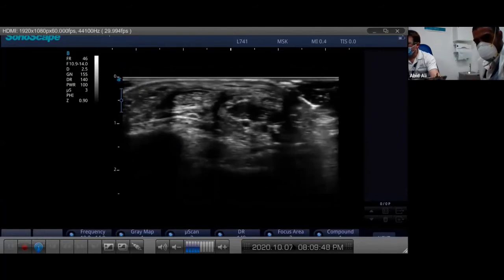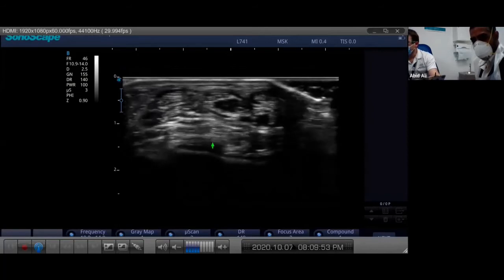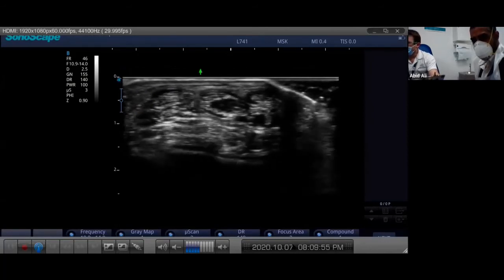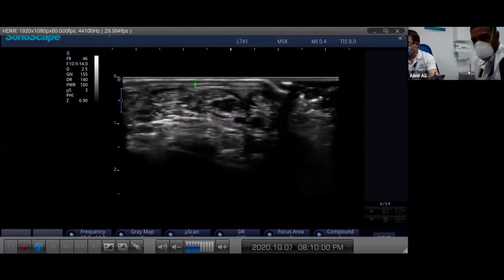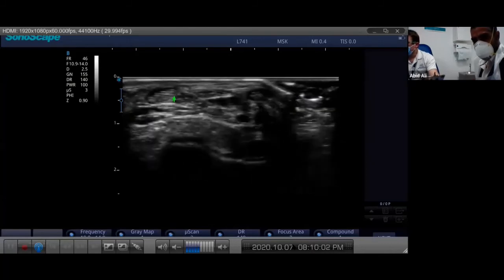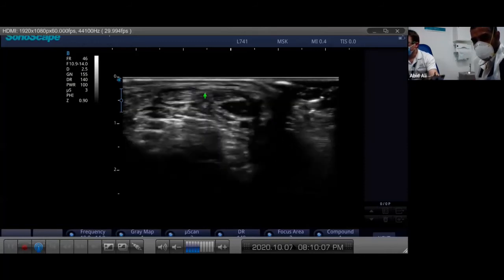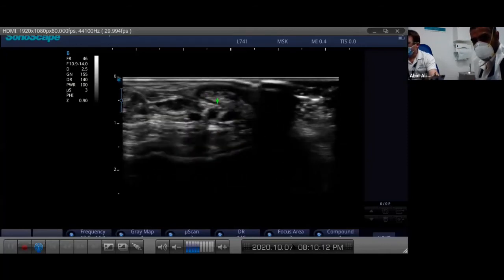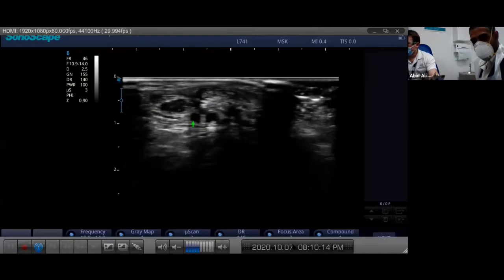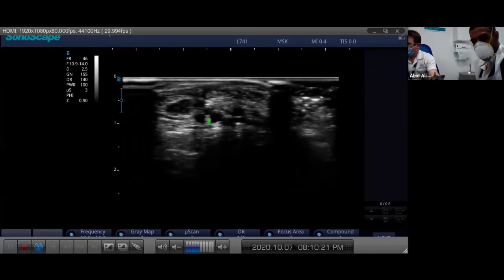So straight away you can see - if you want, just put the pointer at the top of the picture to help orientate everybody. We've got skin right at the top here, and then you can see quite nicely some tendons here in cross-section. If you chop a sausage in half and look at the end of it, that's a cross-sectional view. You can see here is a neurovascular bundle as I'm scanning over the lateral side.